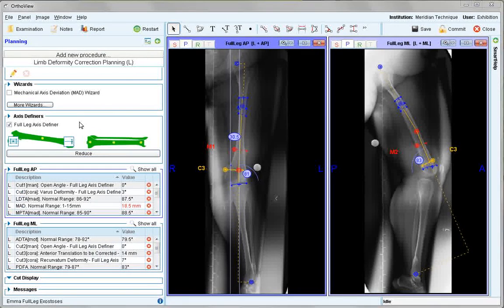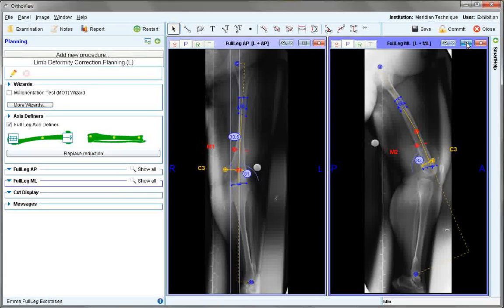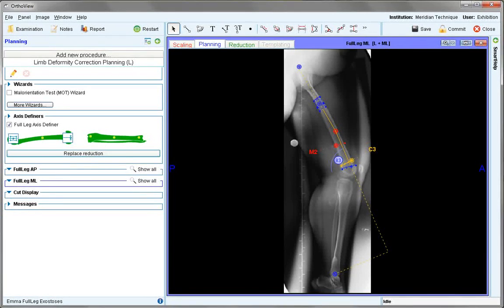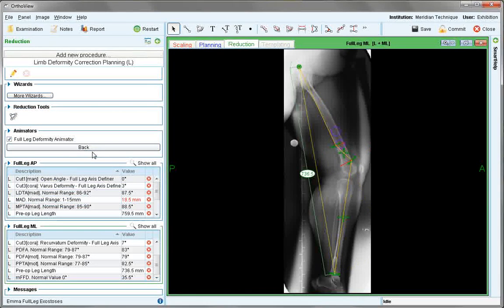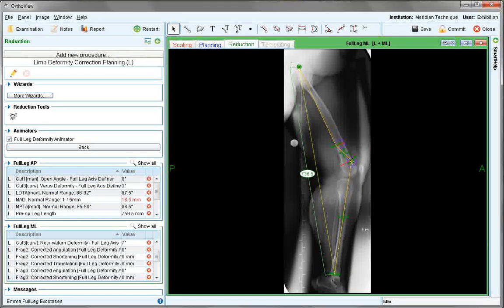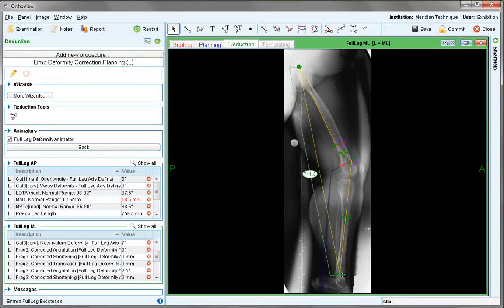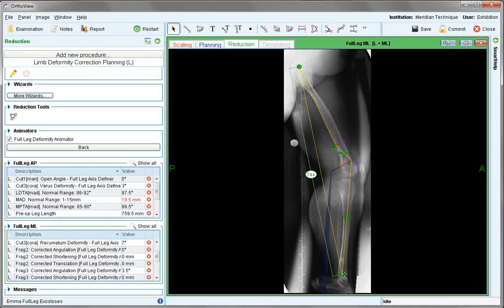It is now possible to reduce the image after using the wizard and axis definers. We choose the lateral image and expand, then choose reduce. The purple circles again represent the hinge points, and it is important to choose the correct one associated with the cut.